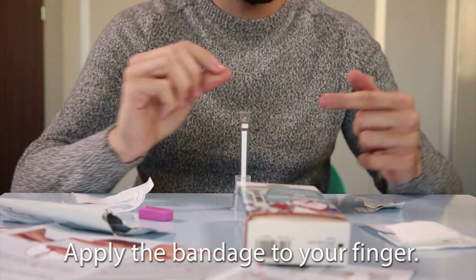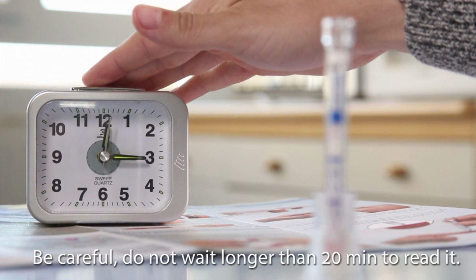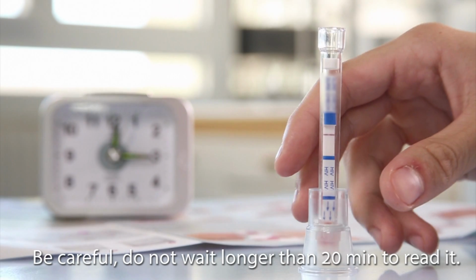Apply the bandage to your finger. Wait for 15 minutes before reading the result. Be careful, do not wait longer than 20 minutes to read it.